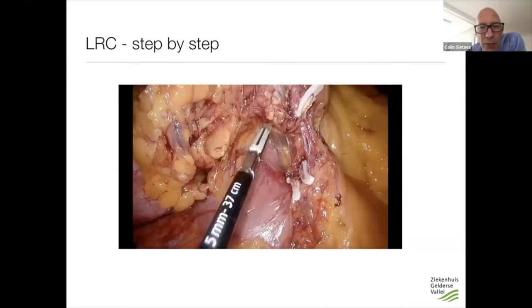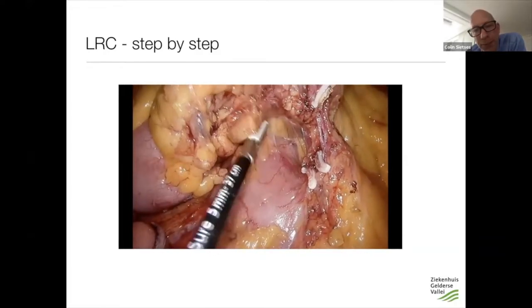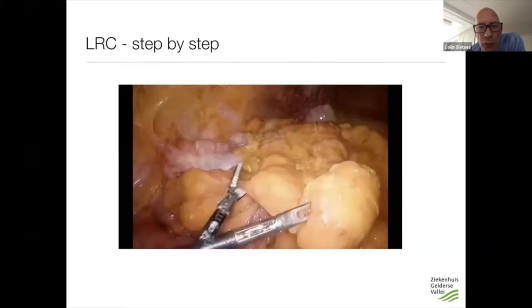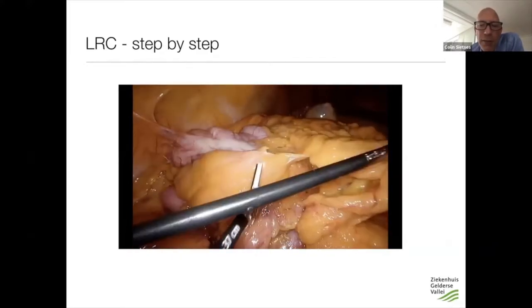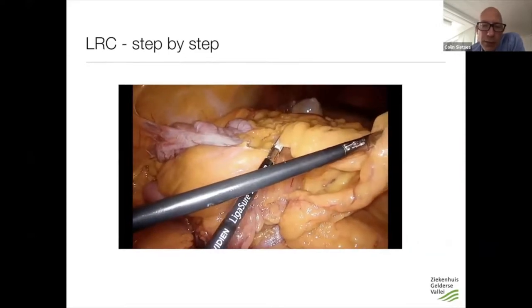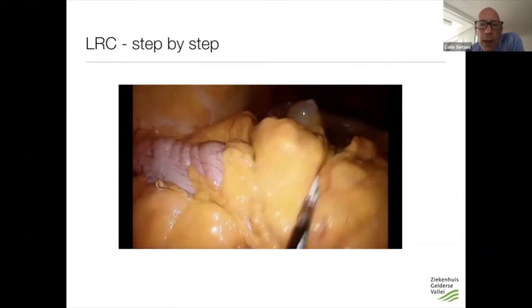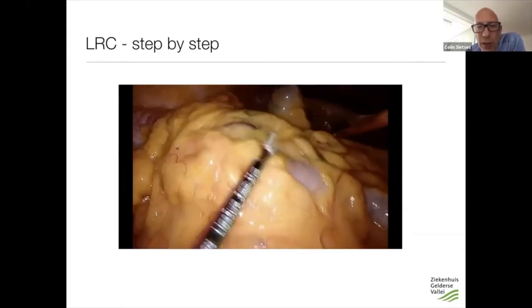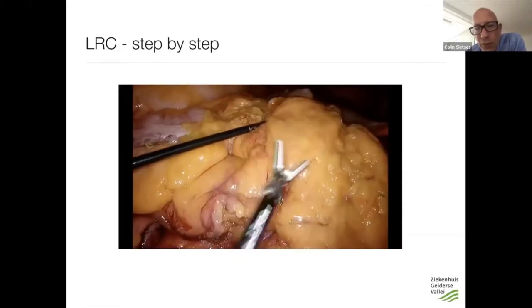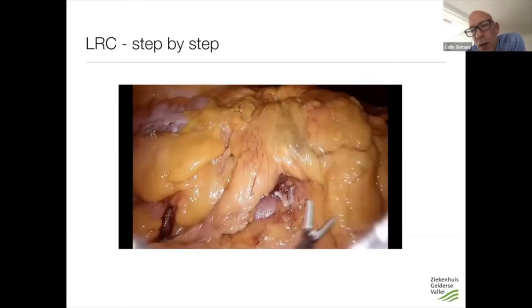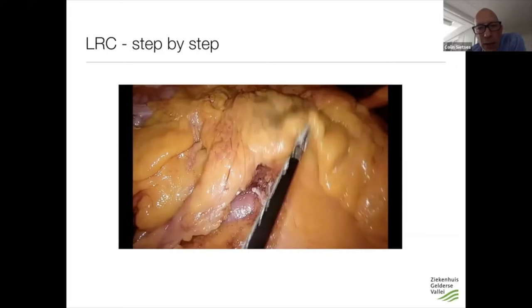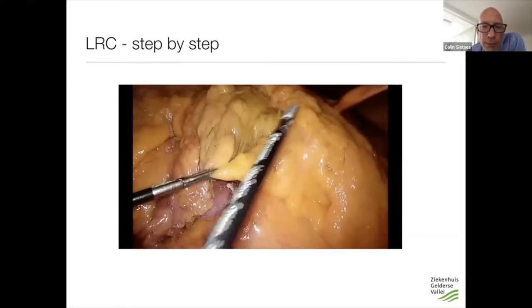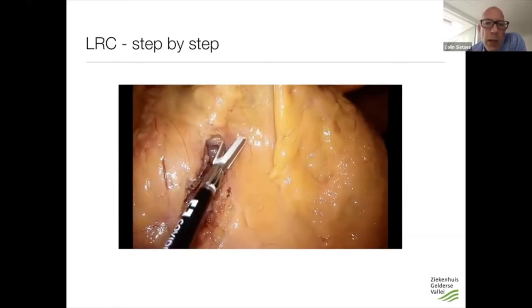You get behind the transverse mesocolon and in front of the pancreas, and you get much more room. The next step is freeing the omentum of the ascending colon. In this case the tumor was in the ascending colon, which we saw on the CAT scan. You can see the tattoo is everywhere in the abdomen — everything is blue, which sometimes happens unfortunately. We flip the omentum over the transverse colon, and then you see we can cut the mesentery of the transverse colon.